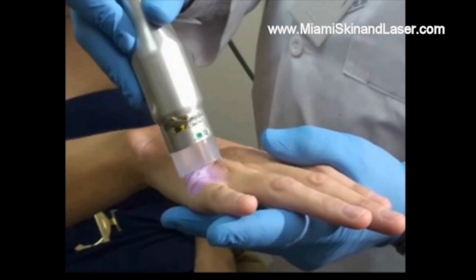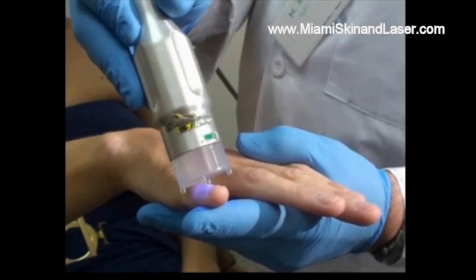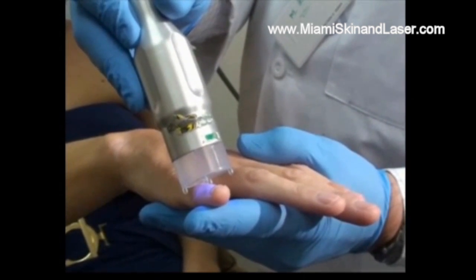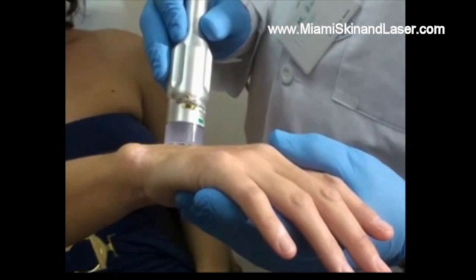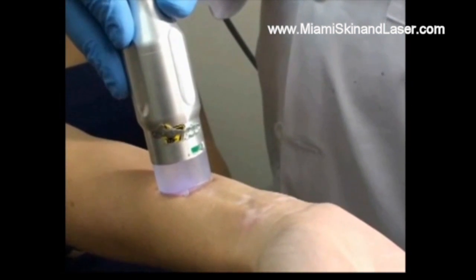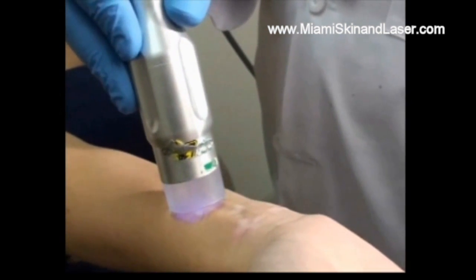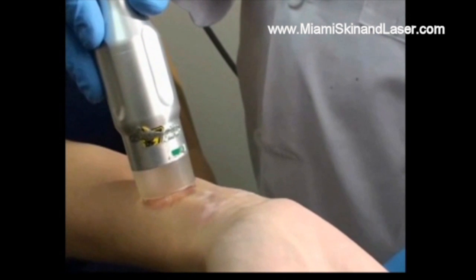There's also a spot on the finger to treat. Certain areas of the skin respond better than others, but with Martine here, we've been very pleased with the results.